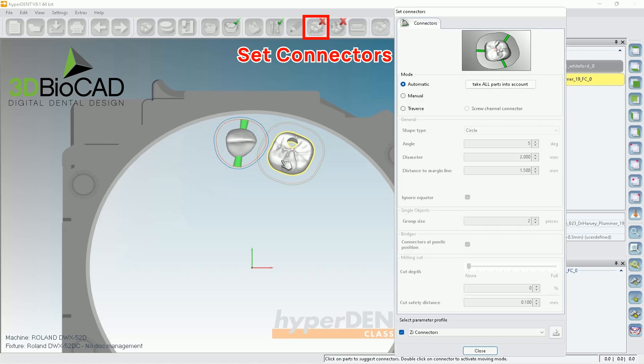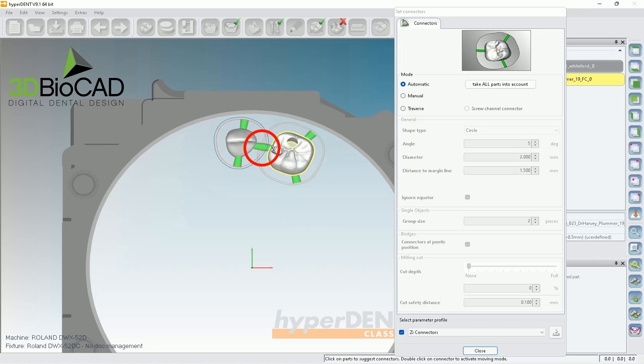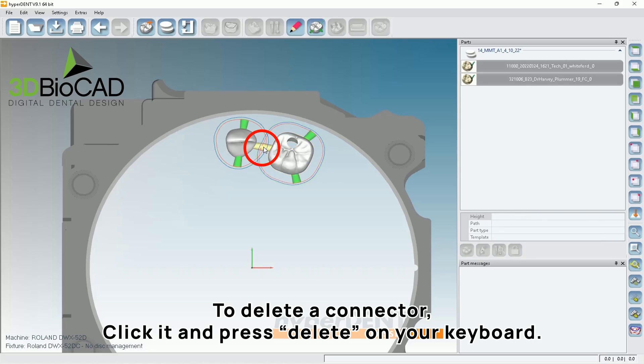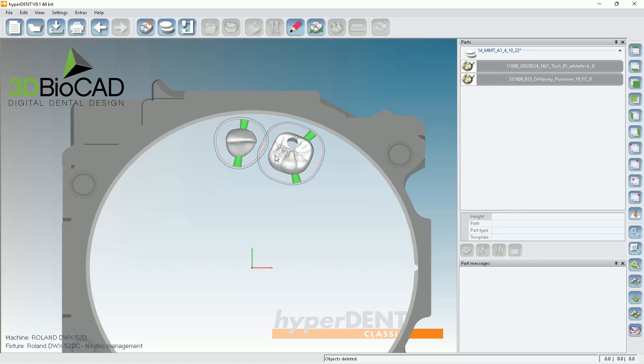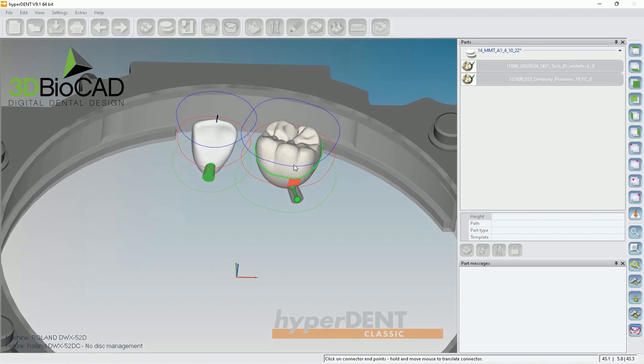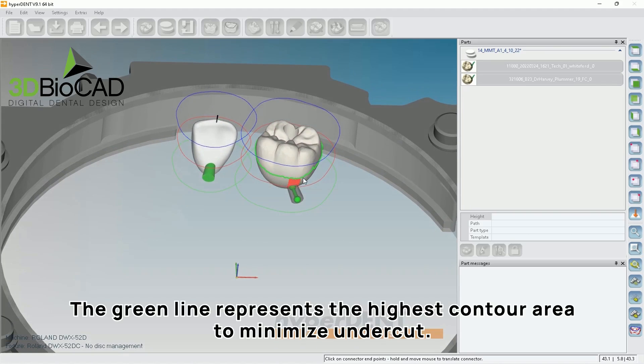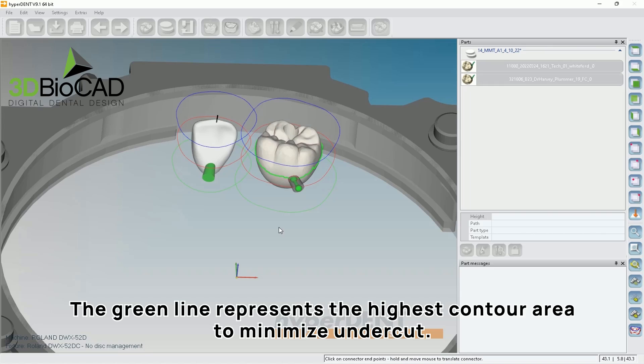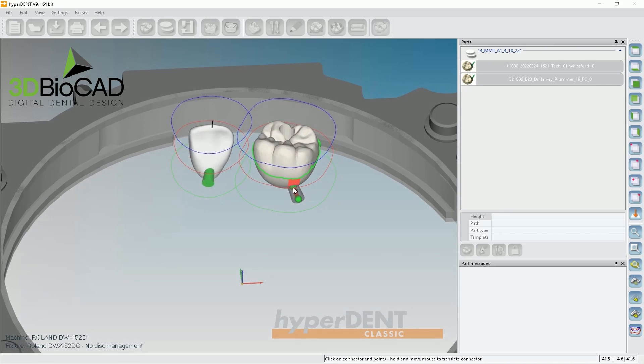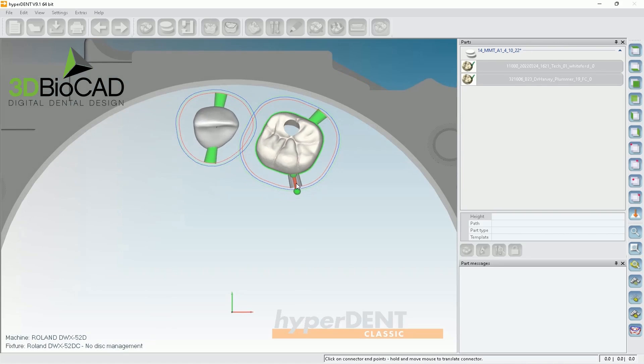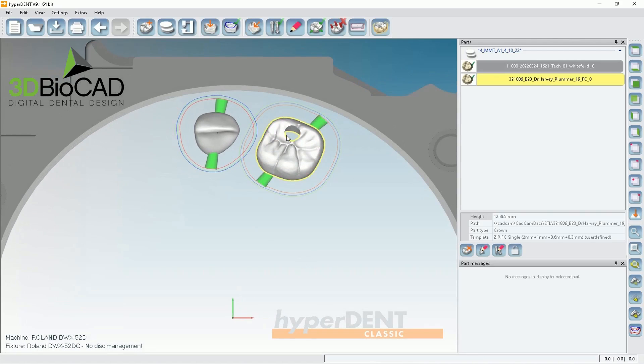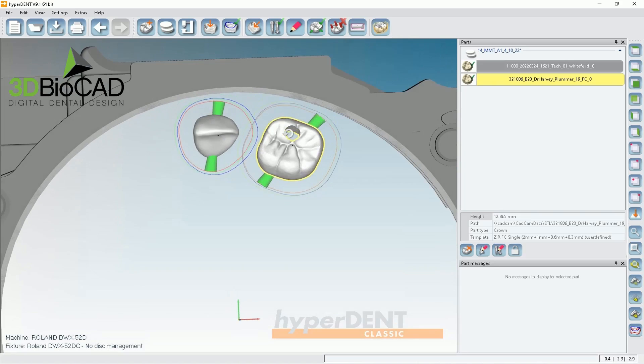And go to connector and click. And it'll try to connect them, too, automatically. But I don't want to have connectors on mesial and distal areas. So I'm just going to delete them. And double click on this connector or screw. And you see, it'll generate green lines. So what this green line represents is the highest contour area to minimize undercuts. So if I bring this to the green area, then I'm not going to have an undercut on top or bottom. But you see, if I bring this down, then it'll have this much being undercut. So just bring it up. And then click on the top view and bring the connector bar. And I just bring it to the other side.